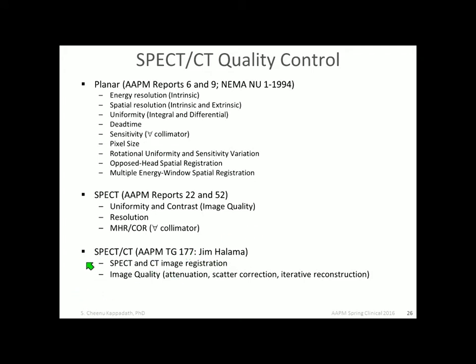And so the SPECT CT component of that, we have one new test that we've incorporated, and that is the SPECT CT image registration. It's going to be a new test that the AAPM is going to recommend the community follow when we do annual acceptance testing of SPECT systems.